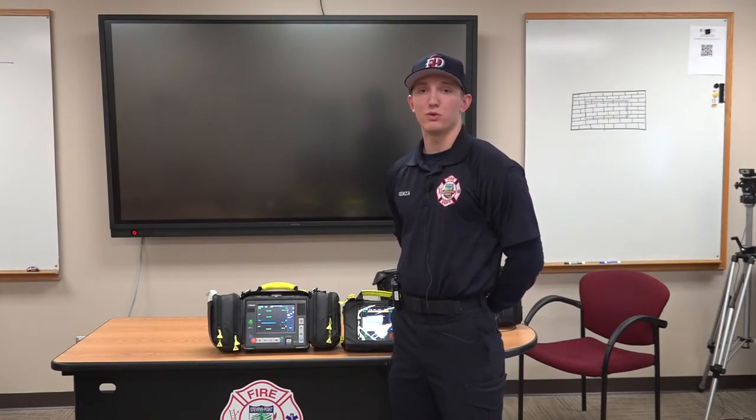We are very excited to put these monitors on our ambulance to continue our quest to better serve our community. Thank you.